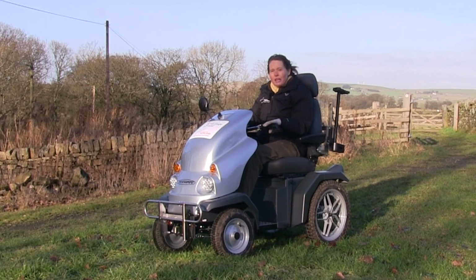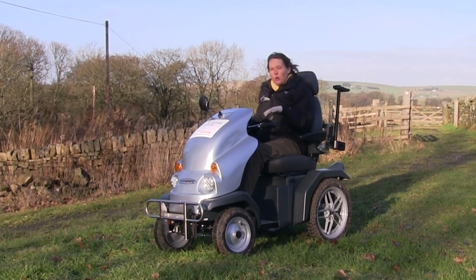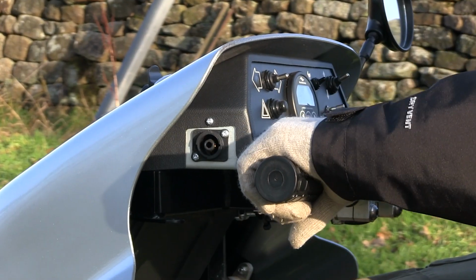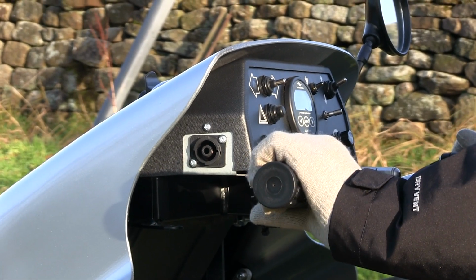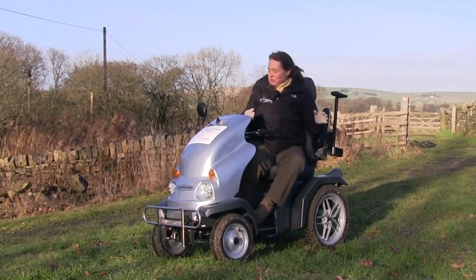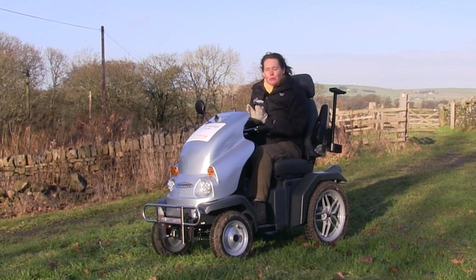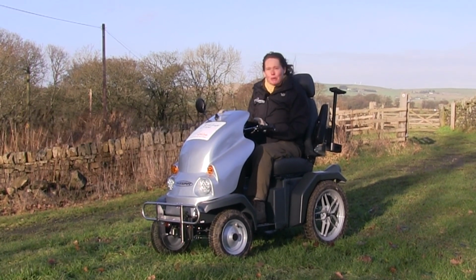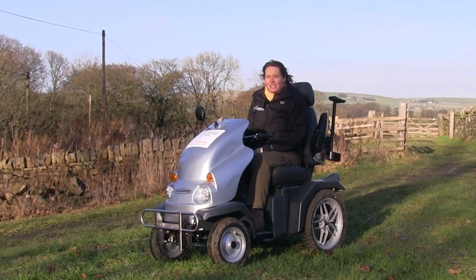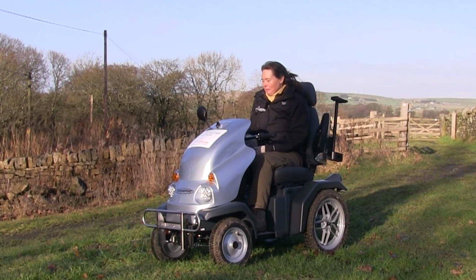When you stop, if you stop the Tramper and you're thinking of getting out of the Tramper, always turn the key off, because if you're tempted to get out, sometimes people will put their hand on the grip and twist and move, and if you do that and the key's on, then the Tramper will move. So it's much better to turn the key off, then the Tramper's fine. The other thing to remember when you stop is try and remember to leave the Tramper in the forward motion position, because otherwise when you start to move again, you might go backwards when you're expecting to go forwards.